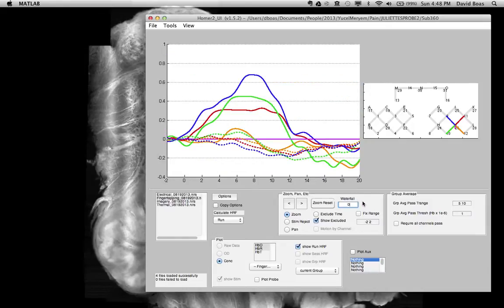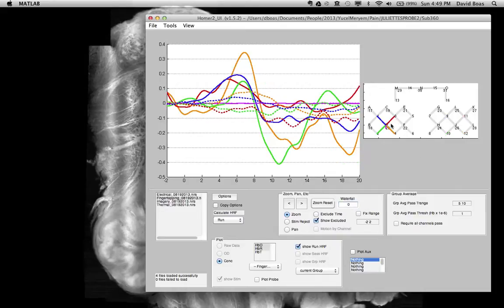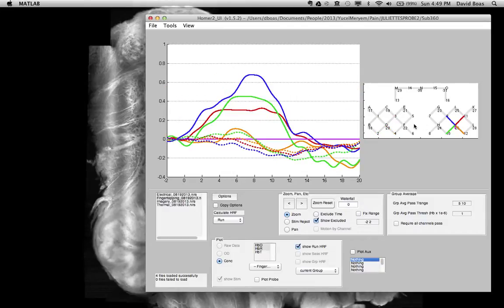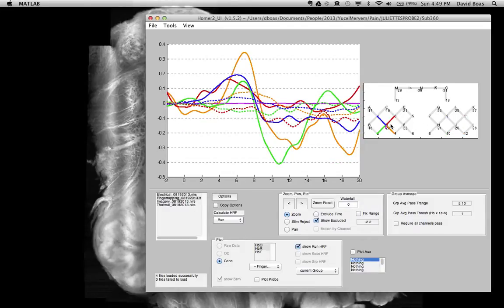This is particularly useful for the next feature, which is selecting multiple channels of data. You know that if you click around, you get different channels of data. But what if you want to compare, in this case, the left hemisphere with the right hemisphere?